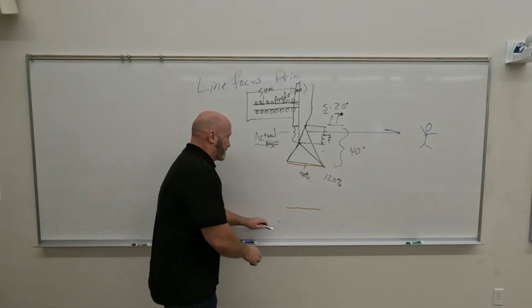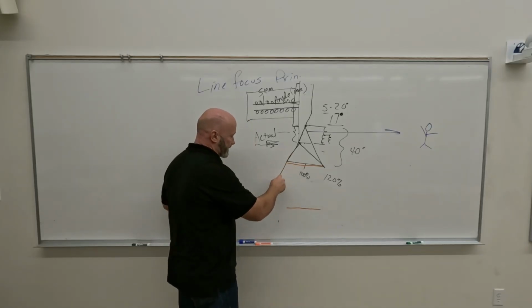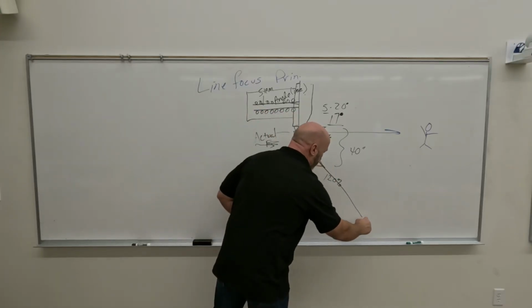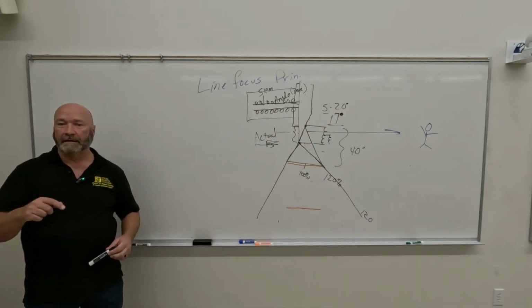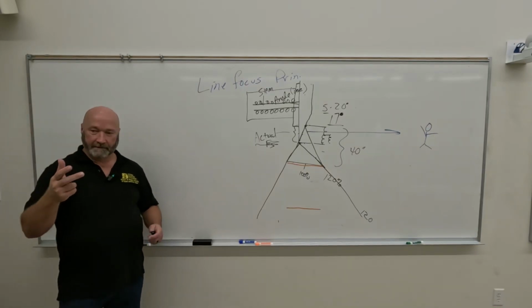All right. So what do we call the spreading out of the X-ray beam? Divergence. Okay, so now where is my 120? Not even on the IR. Bingo. So what are your rules for collimation? Two things. Always collimate to the size of the anatomy and never larger than the IR.